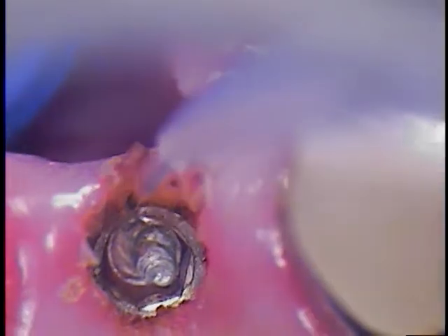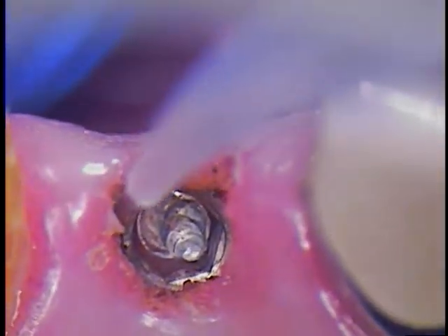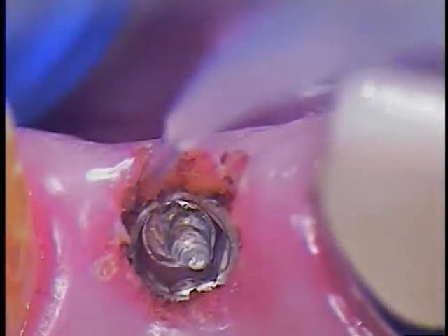Anything to drop down in there, so we're just doing a little extra house cleaning here. Okay, time to put a wrench on it. Okay, so I'll just take off my laser glasses for now. You can leave yours on, patient can leave his on. I'm gonna just zoom in again. There's our wrench.